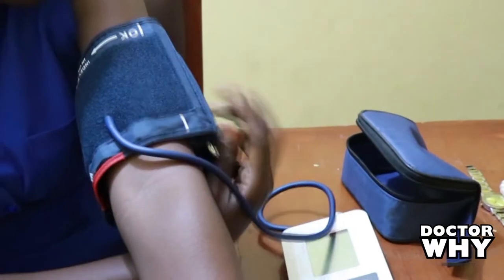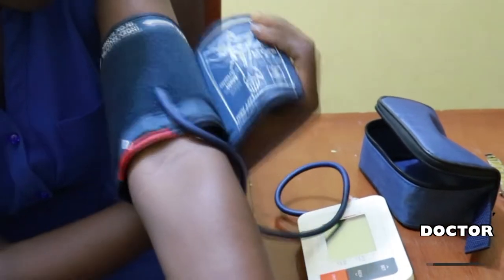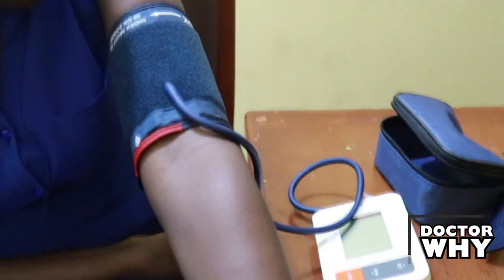I'm going to take you through the step-by-step process of checking your blood pressure at home. First, you need to sit upright — just like I am now. You roll your sleeves up and make sure you do not have anything tight on your sleeve. If your sleeves are on, ensure your clothing is not tight.